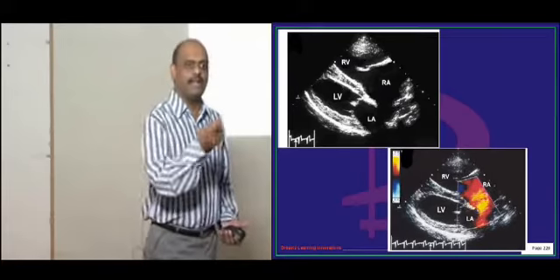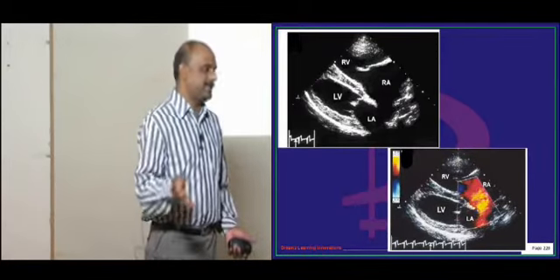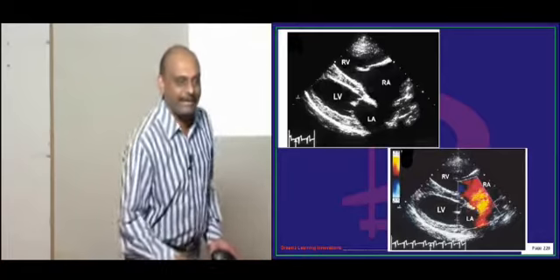Will start mastering how to report ejection fraction and all these things, because machine only is calculating all that.